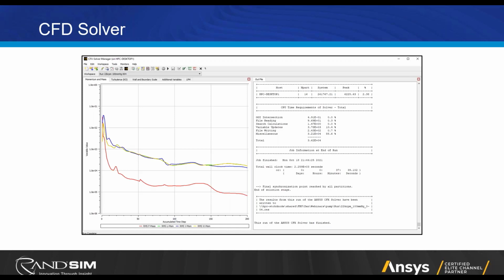You're marching on. These are iterations down here. And you generally want these residuals or the imbalance to be decreasing with time. So you're getting closer to a converged solution. I don't show it here, but you can also monitor values, different things in your domain, which is also a very good indicator whether it's converged or not. In this case, maybe look at the pressure at the outlet, for instance, and see when it's changing. Or if you're calculating the flow rate, which is also done sometimes, you can monitor that and see when that stops changing. So basically, a steady state solution like this will be converged when residuals are relatively low and the variables you're solving for are not changing with time, or iteration, I should say.